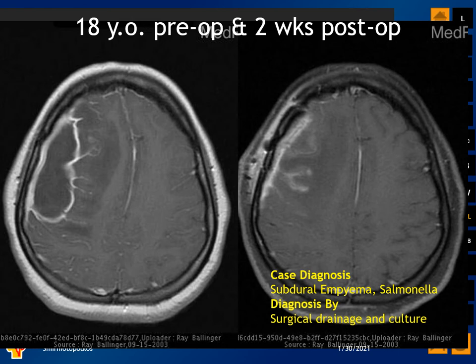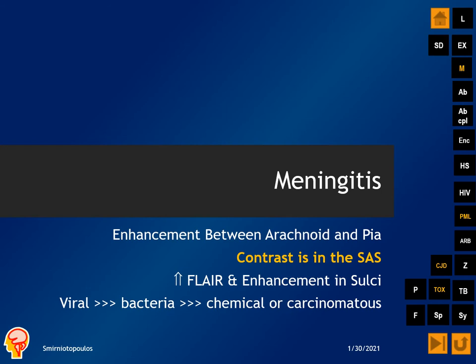Let's now turn our attention to meningitis. Meningitis typically demonstrates contrast enhancement between the pia and the arachnoid. This is caused by contrast leaking out of inflamed vessels directly into the subarachnoid space. There should also be increased FLAIR signal in the subarachnoid space in addition to the enhancement in the sulci. The most common causes of meningitis are going to be viral, much more commonly than bacterial. And we also want to remember that patients can have chemical or carcinomatous meningitis that will cause contrast enhancement and abnormal FLAIR signal within the sulci.